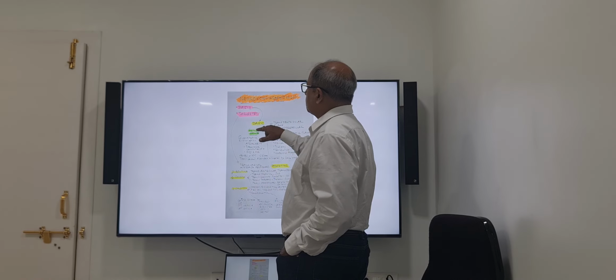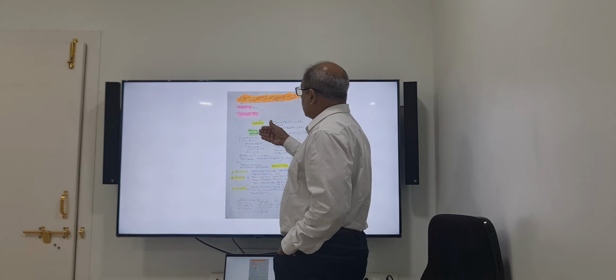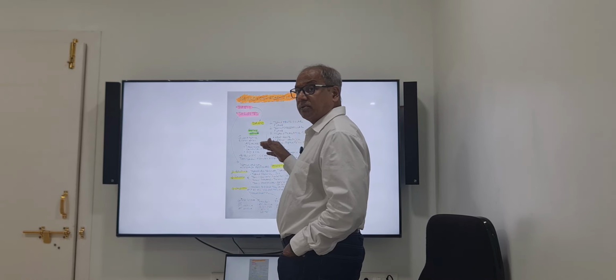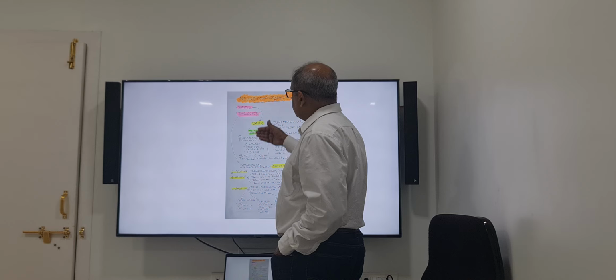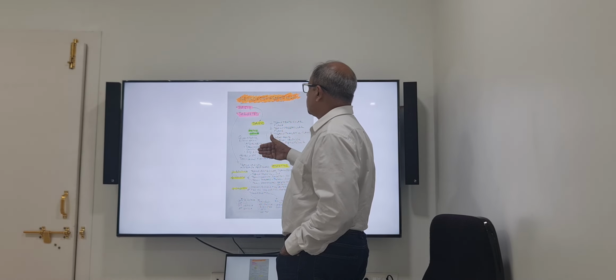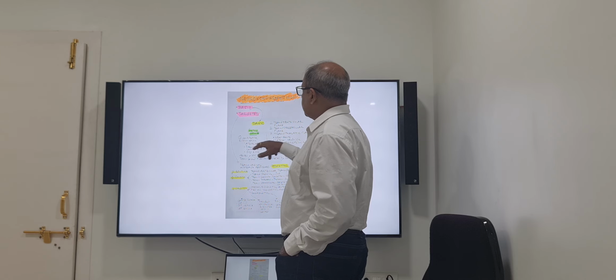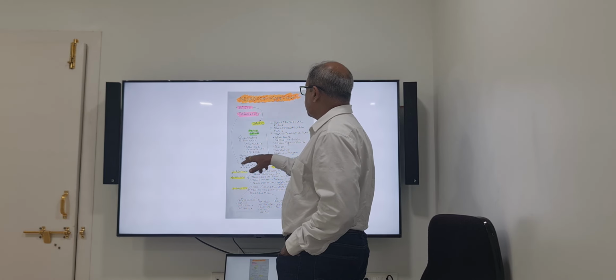Now for the basic fetal spine, in the 20+2 scan, we should do a coronal, a sagittal and a transverse of each and every vertebra. What is the quantitative estimation during the basic scan, when we do our regular scan in mid-trimester? That is atrial width, transverse cerebellar diameter, BPD and head circumference.